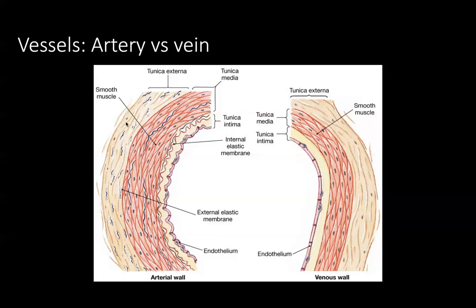You can have angioleiomyomas developing from the smooth muscle of the vessels as well. You can have venous hemangiomas that are primarily composed of venous dilations. You can have mixed arteriovenous hemangiomas, proliferation of both arterioles and venules. So just keep in mind that vessels are a big part of dermatopathology.